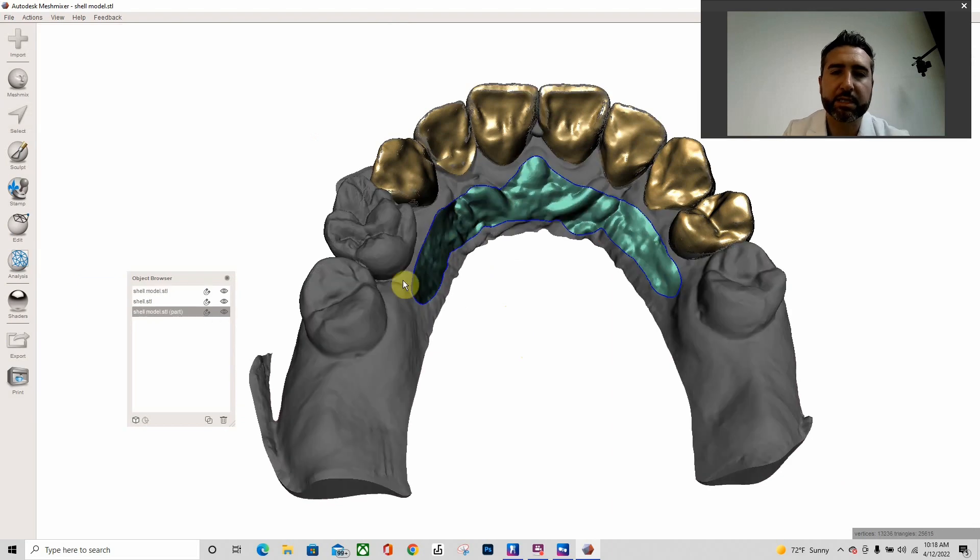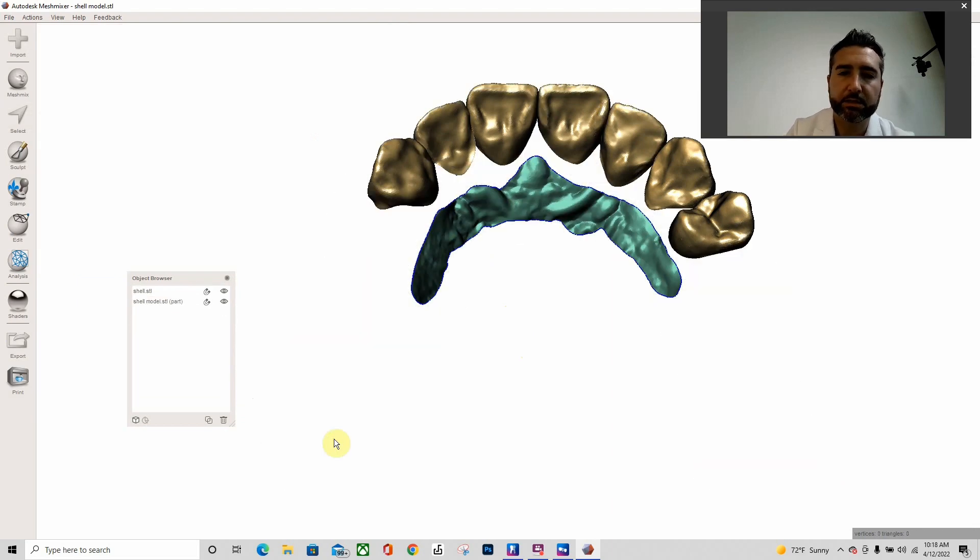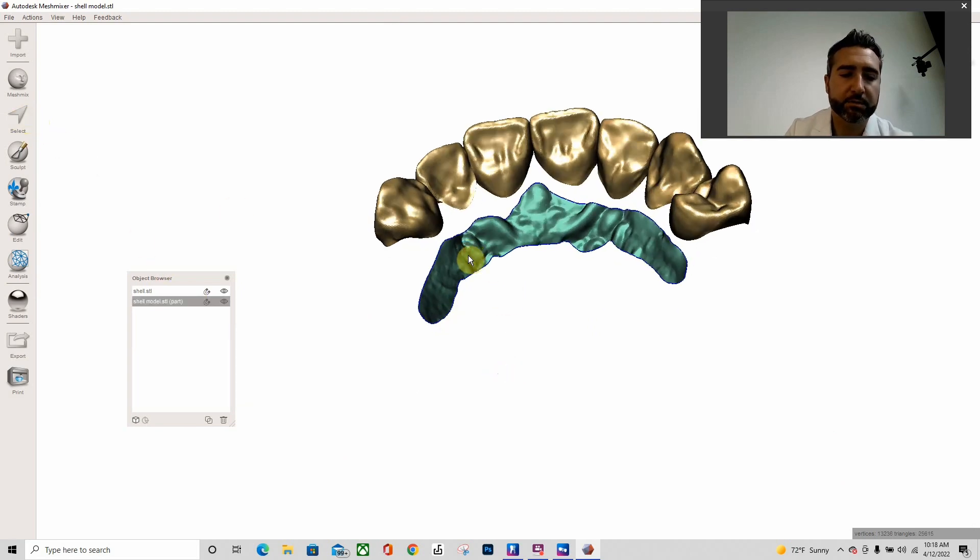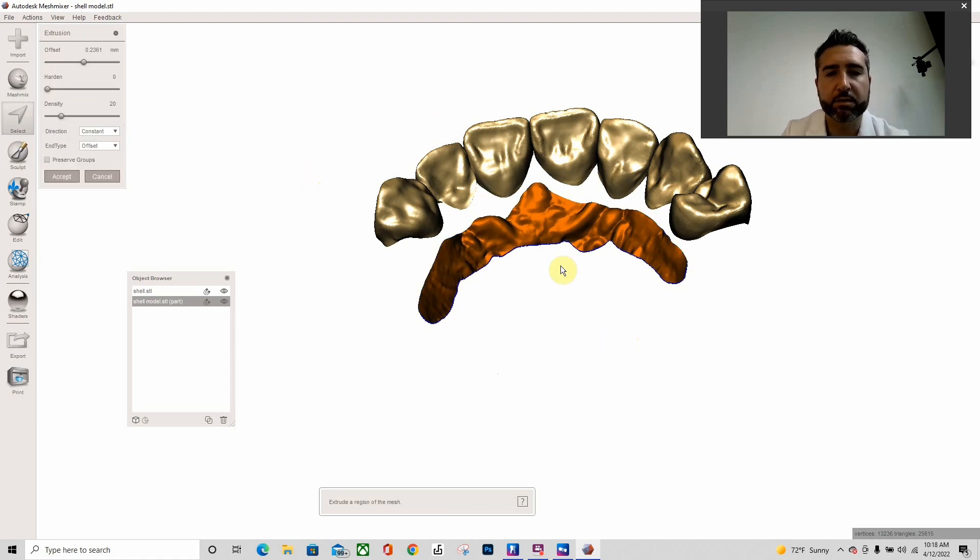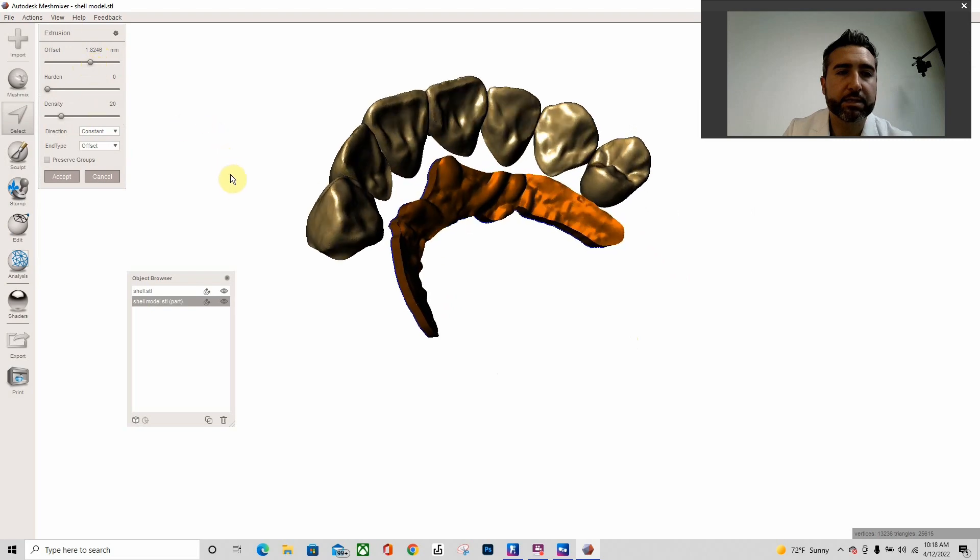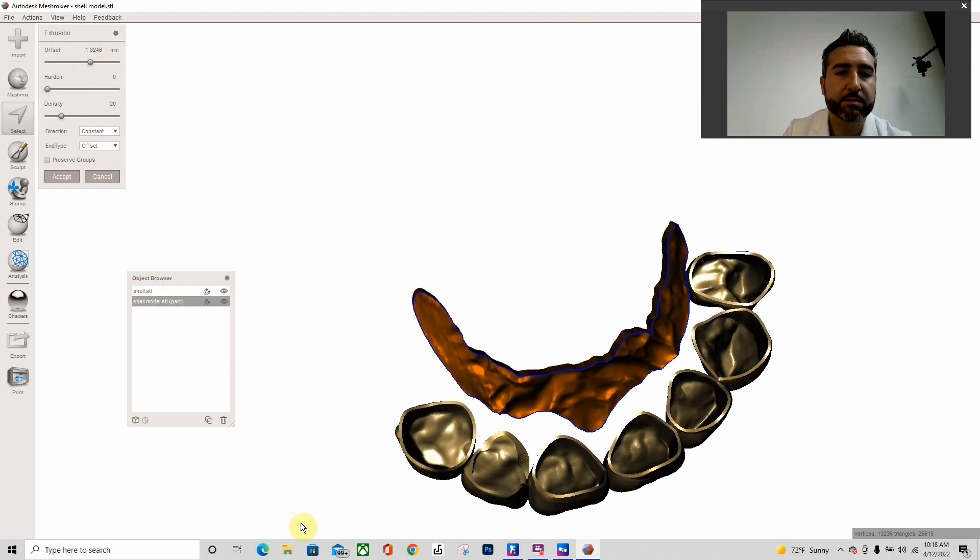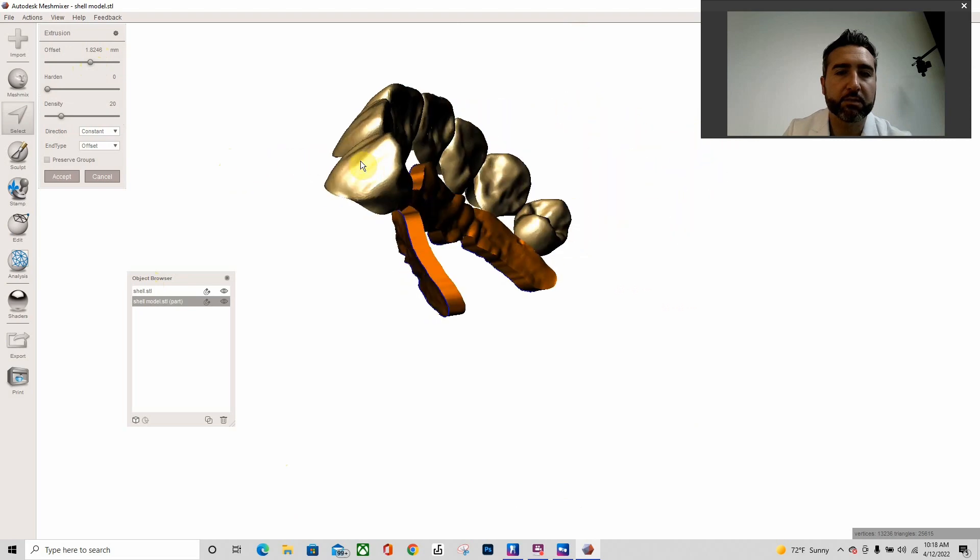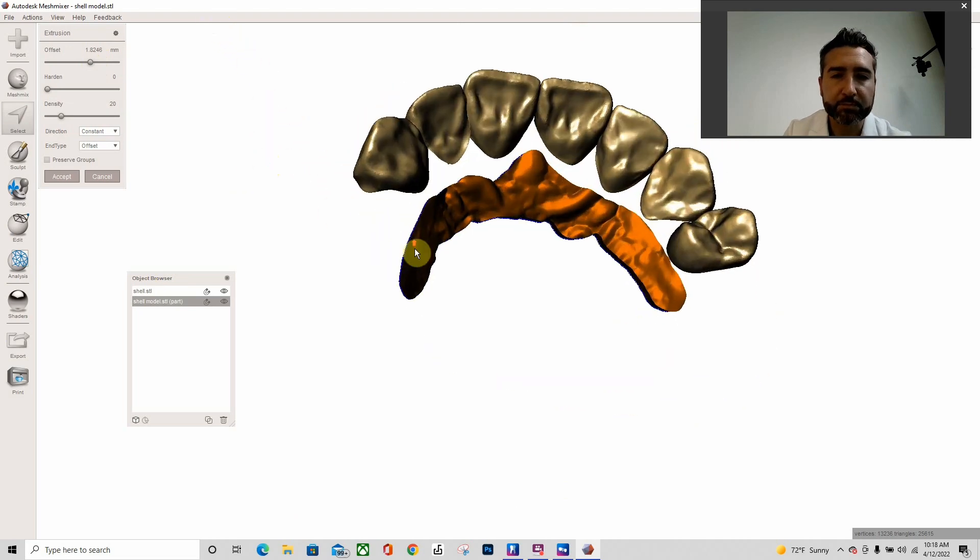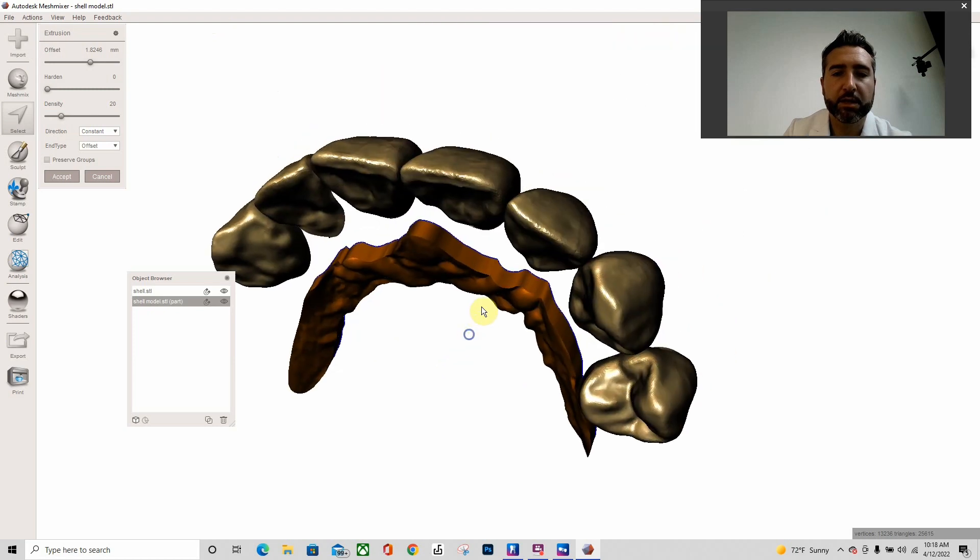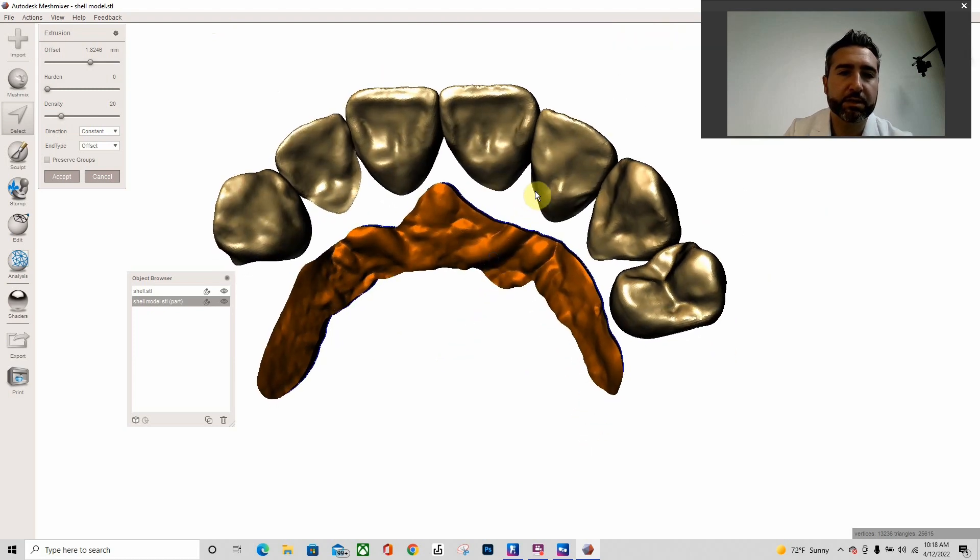And then what I'm going to do is hit Y to separate that mesh out, so now I can delete that model. Then I'm going to come in here, I'm going to Control-A that, to hit D for extrude. And I'm going to go ahead and extrude that just like that to make it at least one and a half millimeters thick, preferentially two.